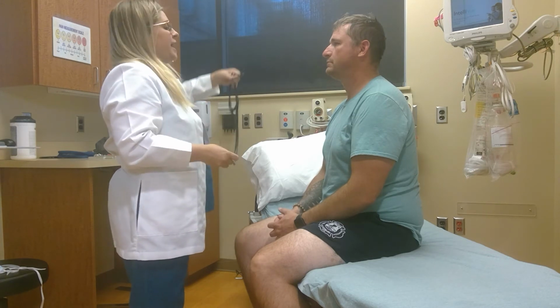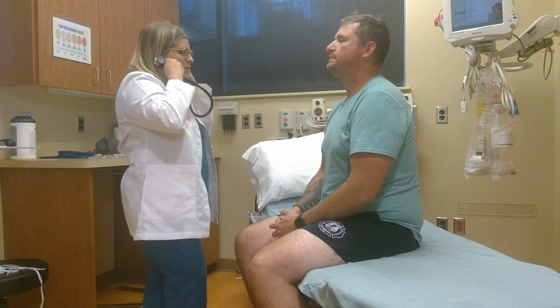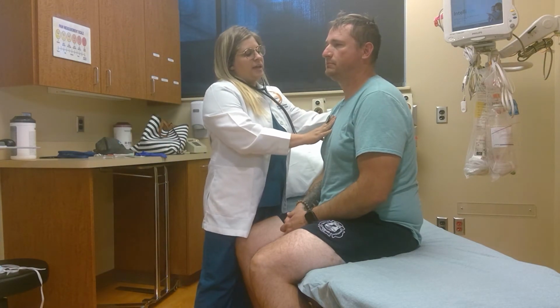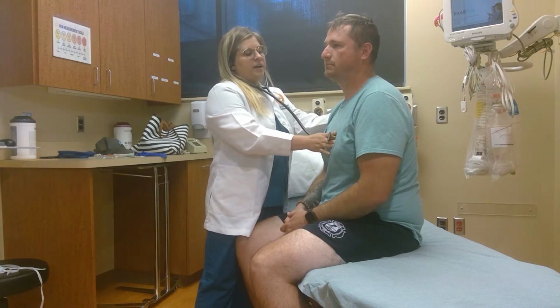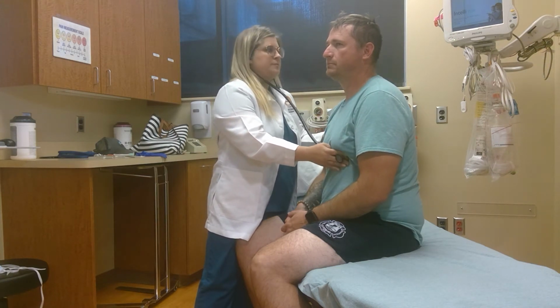So now I'm going to go ahead and auscultate the heart sounds. And first I'm going to listen to the valves. First I'm going to listen to the aortic valve. Pulmonic valve. Tricuspid valve. And the mitral valve.